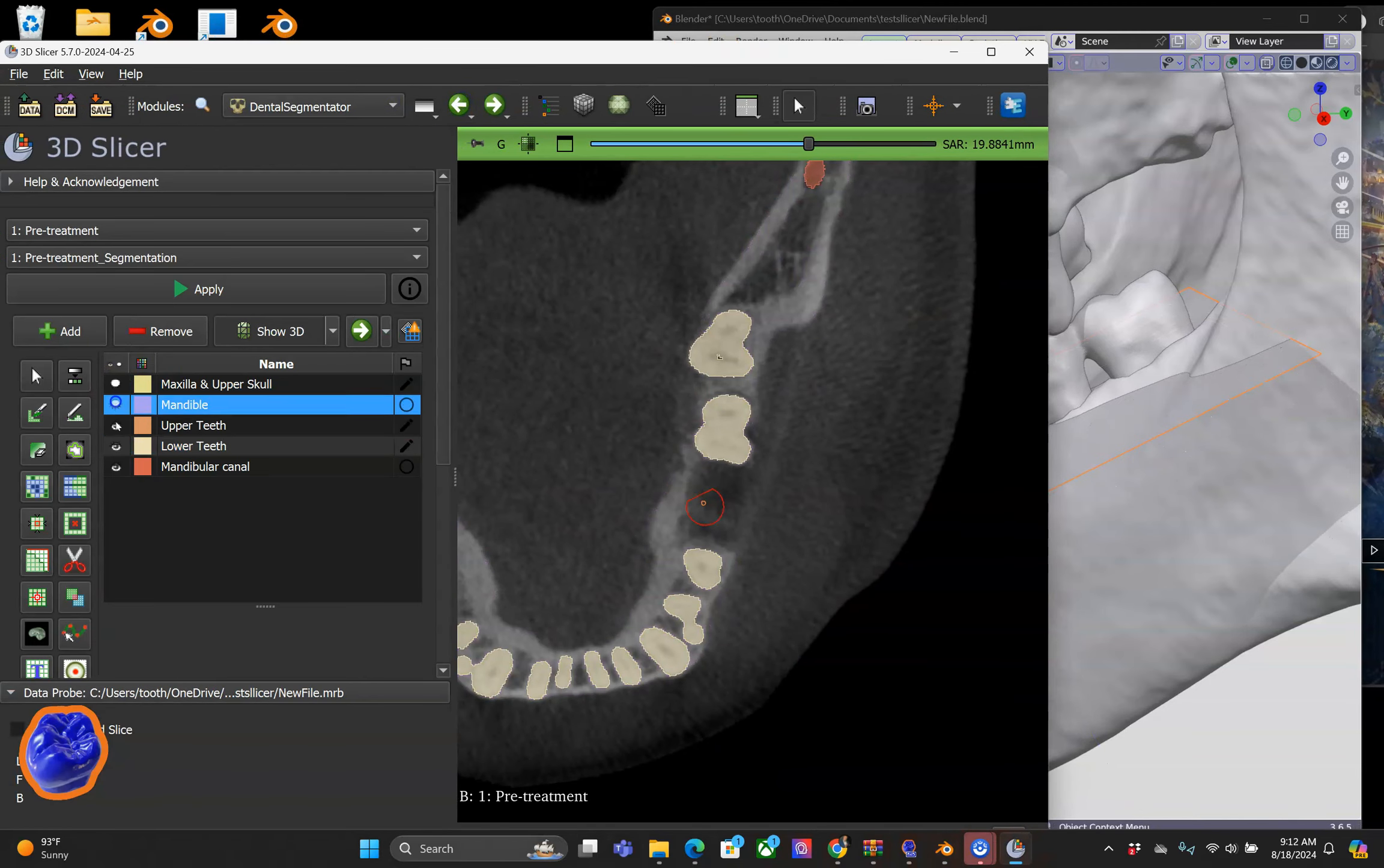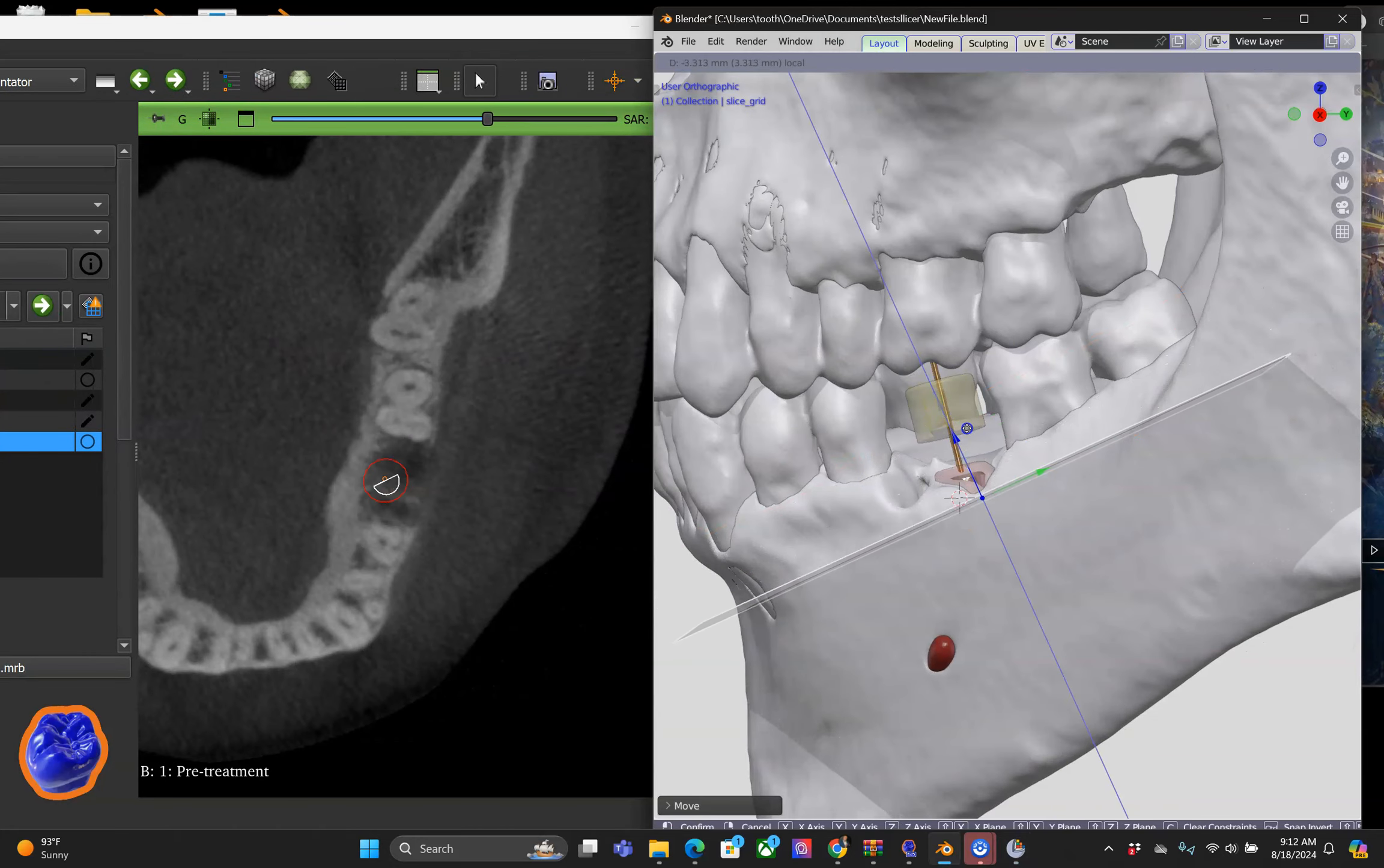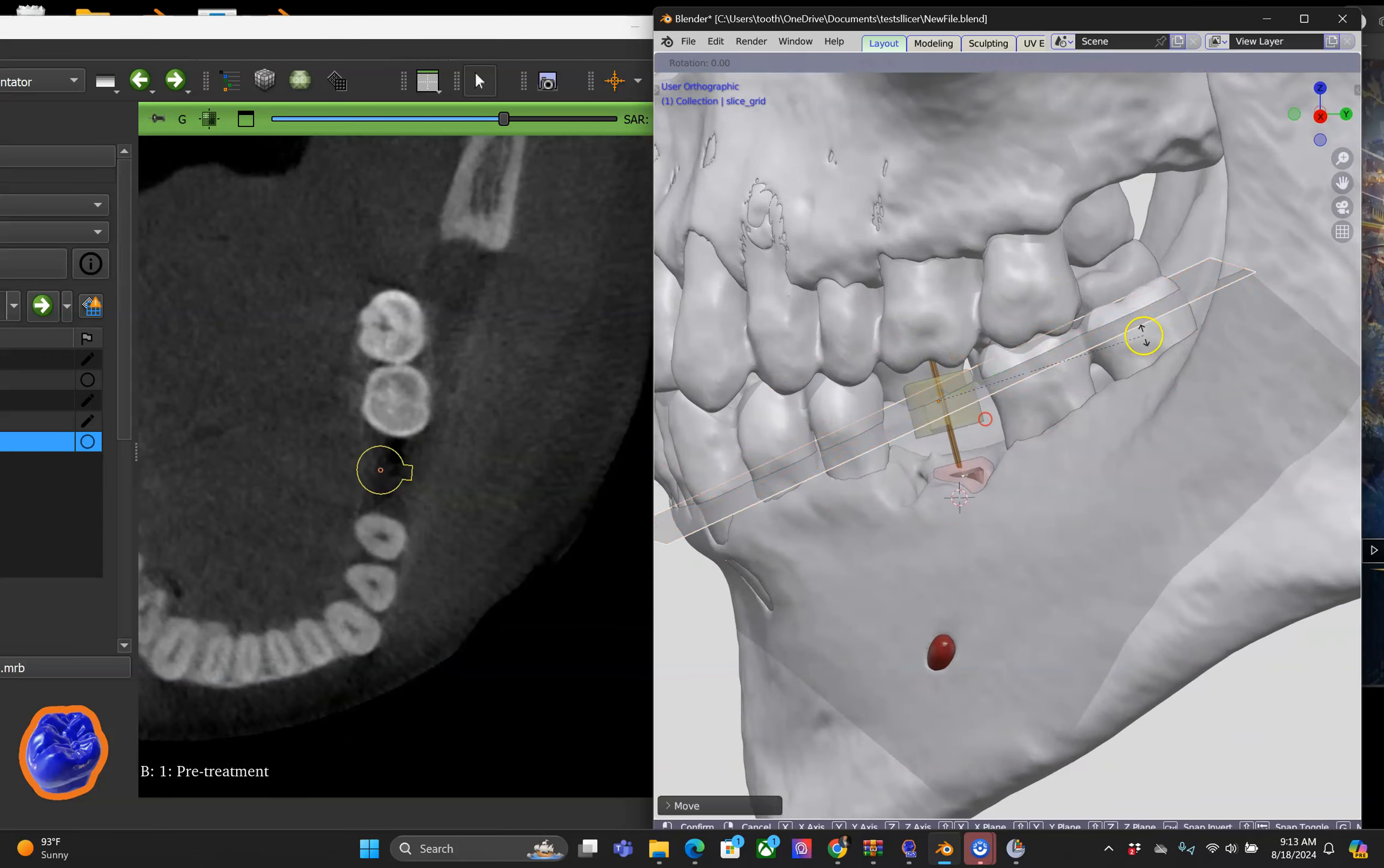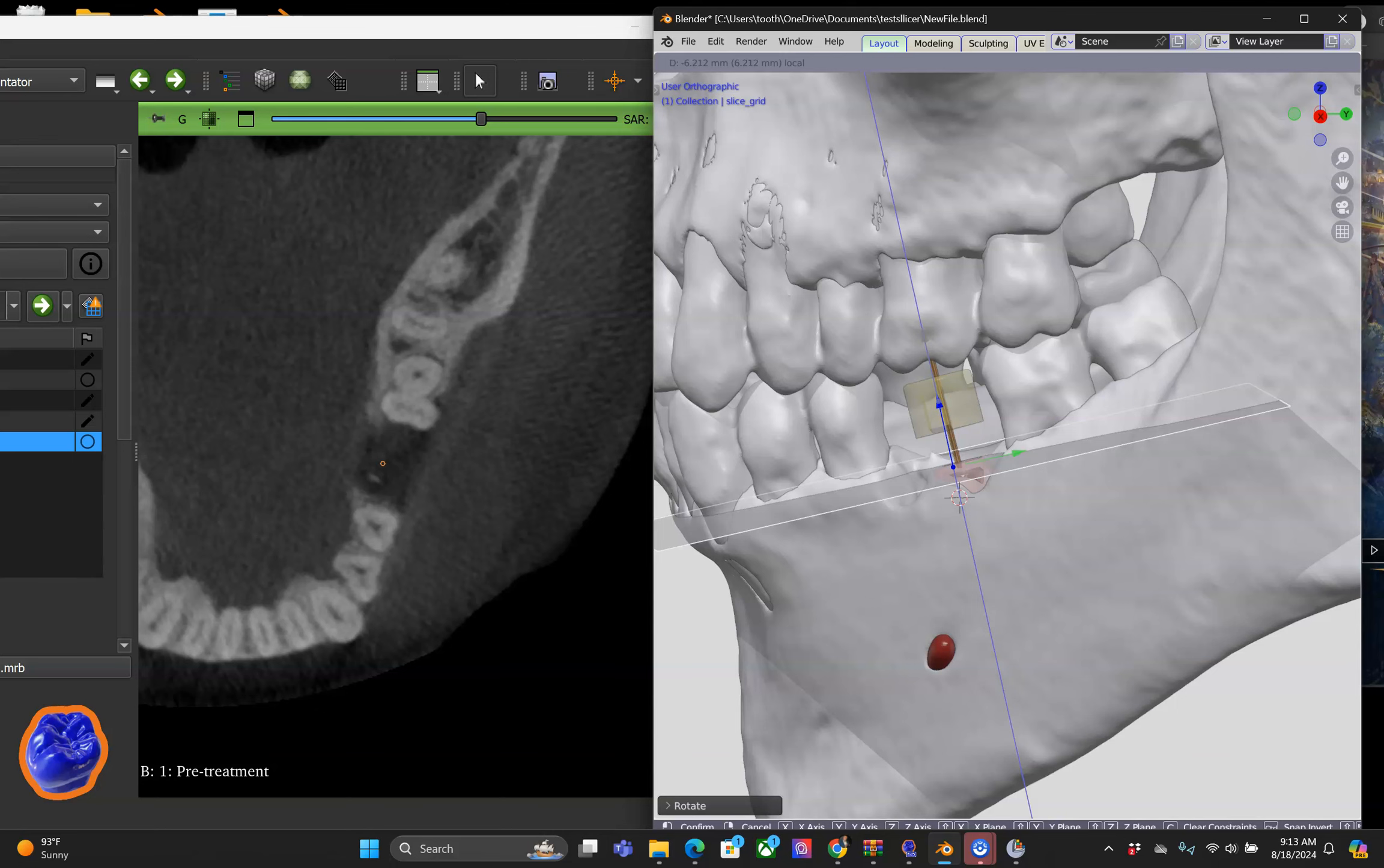I'm going to briefly hide the segmentation model and then continue to show you how incredible this is. We are not limited to any curves because we can create as many 3D Slicer planes in Blender as we would like to.